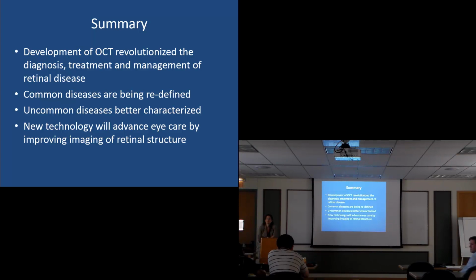How well is OCT being used? Yes, there's a large variance right now. My specialty is medical retina, so I really went into OCT interpretation. But most people who use this for retina and surgical retina don't take the time to break down the layers. So one advance that we need is, my research and my fellowship was looking at the measurements we do to follow disease don't really show us disease.